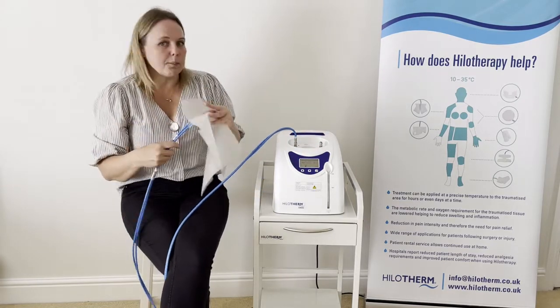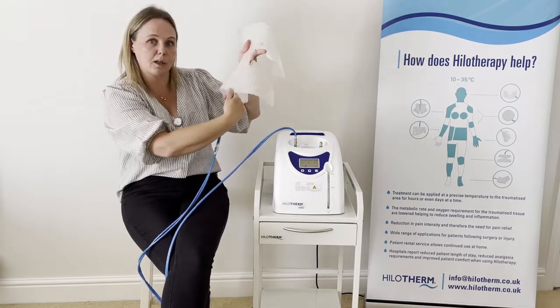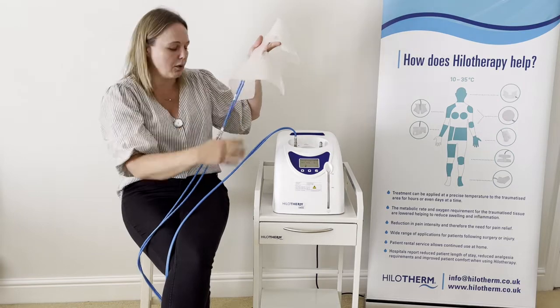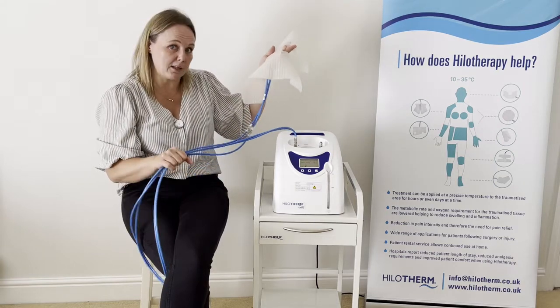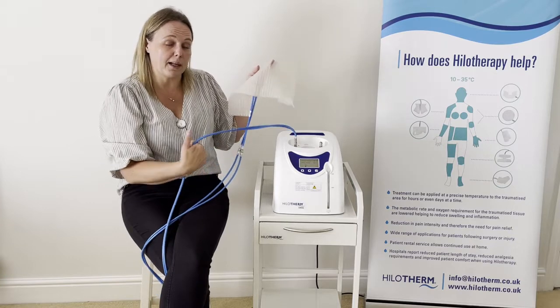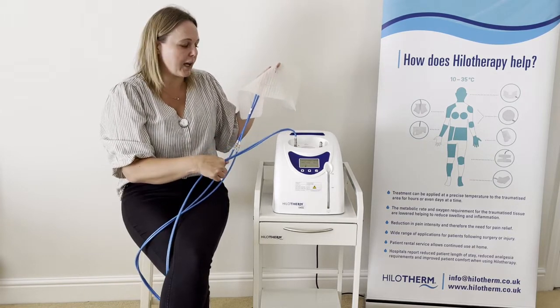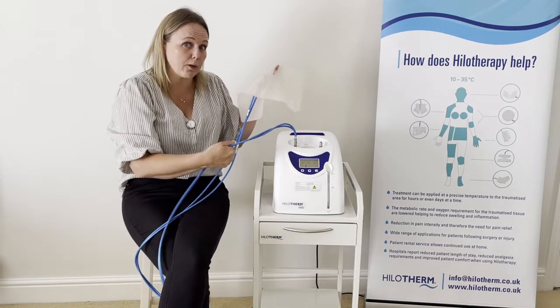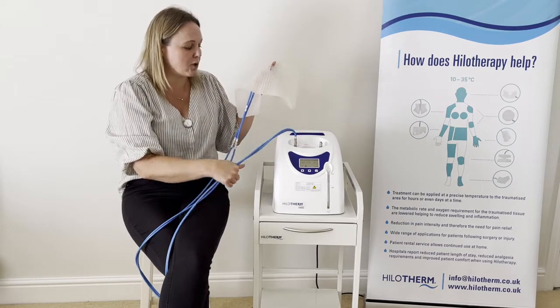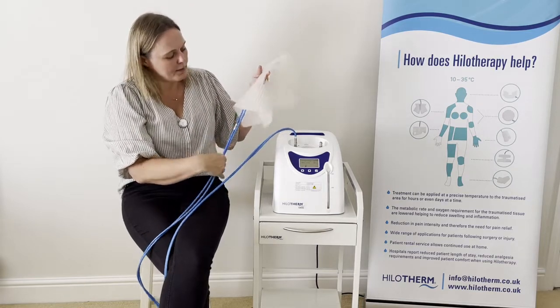The cuff itself is all single patient — from the cuff onward, everything is single patient for infection control. The long blue tubing is not single patient; it is quite expensive to replace and needs to stay with the machine at all times. We generally recommend hospitals label this with 'do not throw away' or something similar.